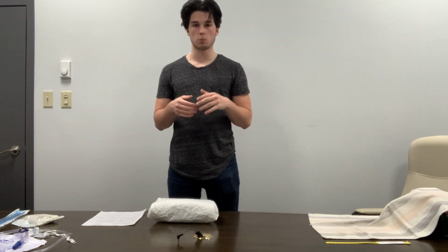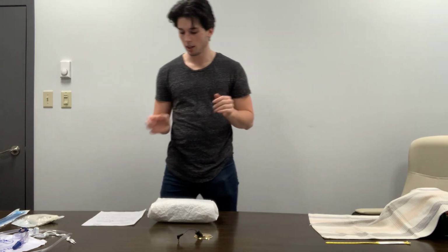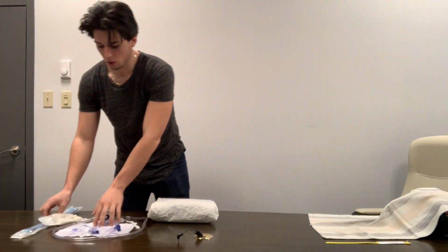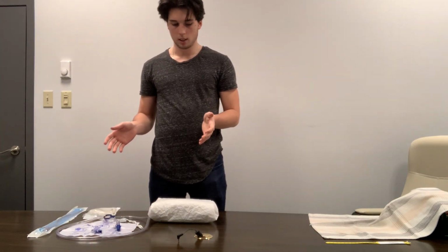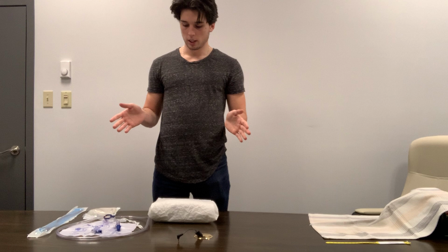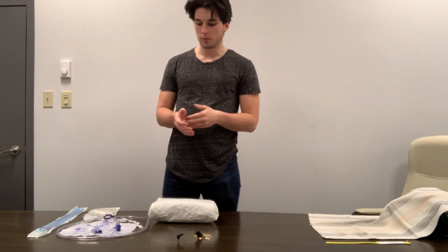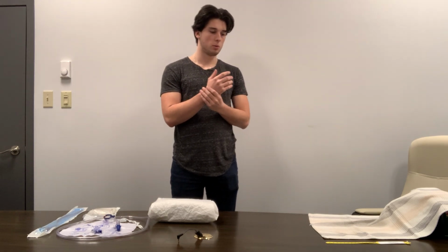We'll gather our supplies as well as wash our hands and make sure pericare is done. In this case, we have already done pericare. So we're going to set aside our physician's order sheet, and we are going to grab all the supplies that we will need for the procedure. And so in this case, once we have all our supplies that you would get from your supplies room in your facility, we are good to enter the patient's room as we make sure we have washed our hands before this procedure.